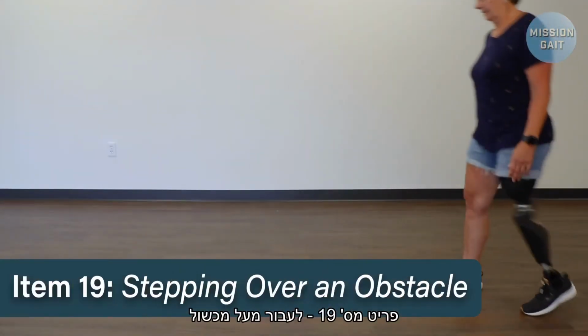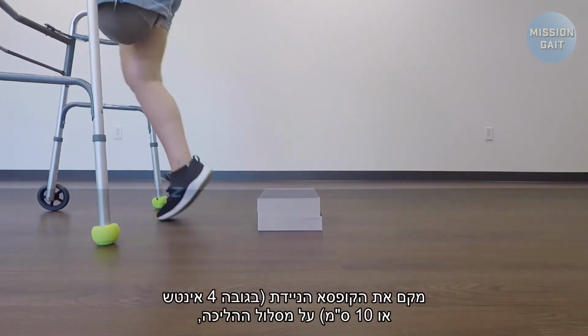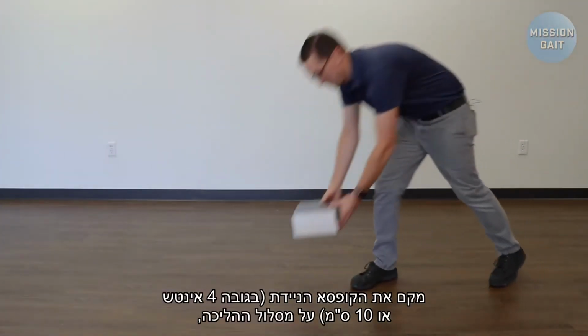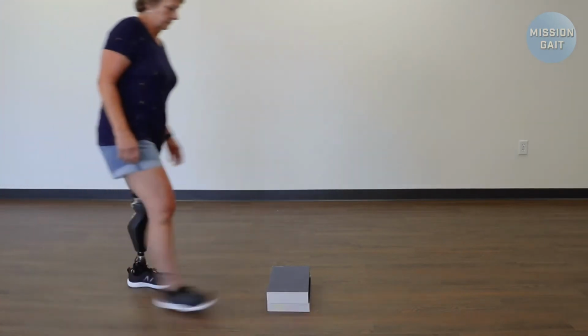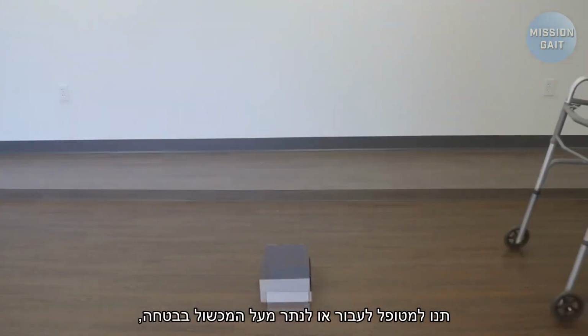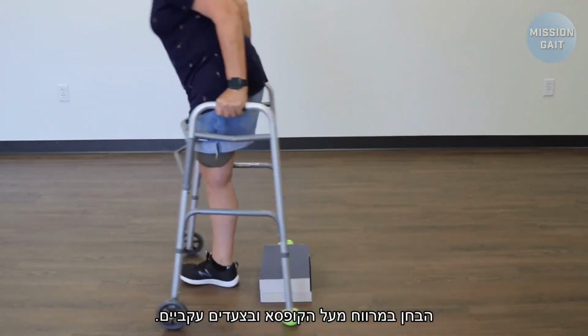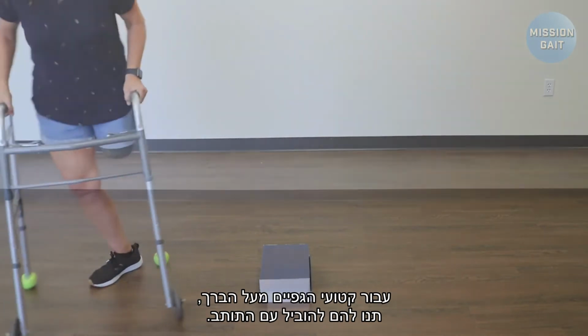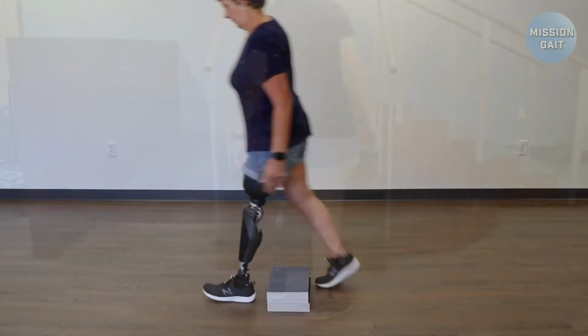Item 19. Stepping over an obstacle. Place the movable box, 4 inches or 10 centimeters in height, in the walkway. Have the patient safely step over or hop over the obstacle. Observe for clearance over the box and a consistent stride. For the above-knee amputee, have them lead with a prosthetic limb.